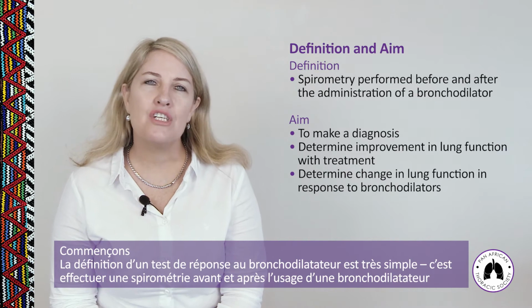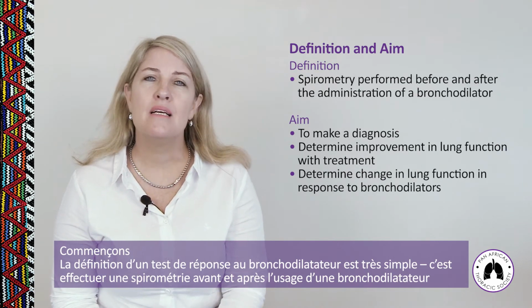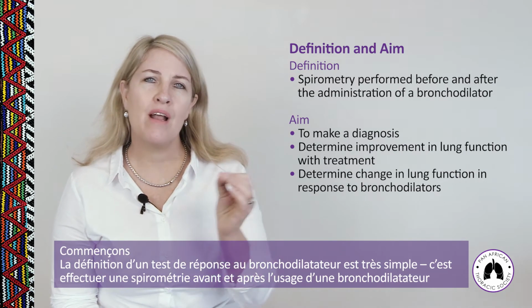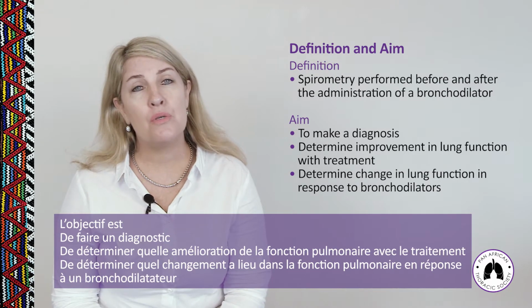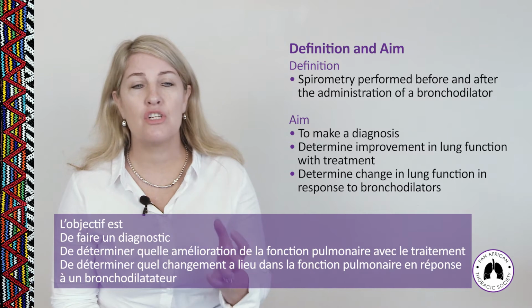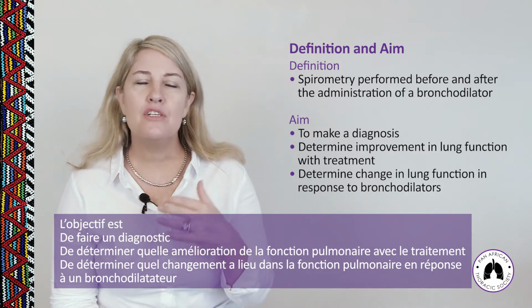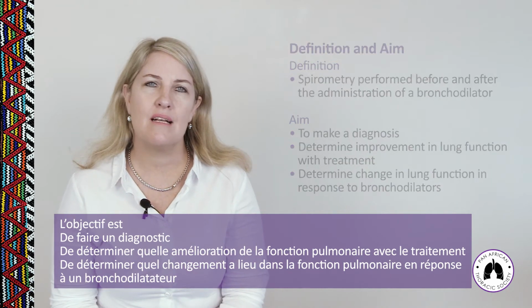Okay, so the definition of a bronchodilator responsiveness test is very simply spirometry performed before and after the administration of a bronchodilator. The aim is to make a diagnosis, to determine improvement in lung function with treatment, and then to determine change in lung function in response to a bronchodilator itself.